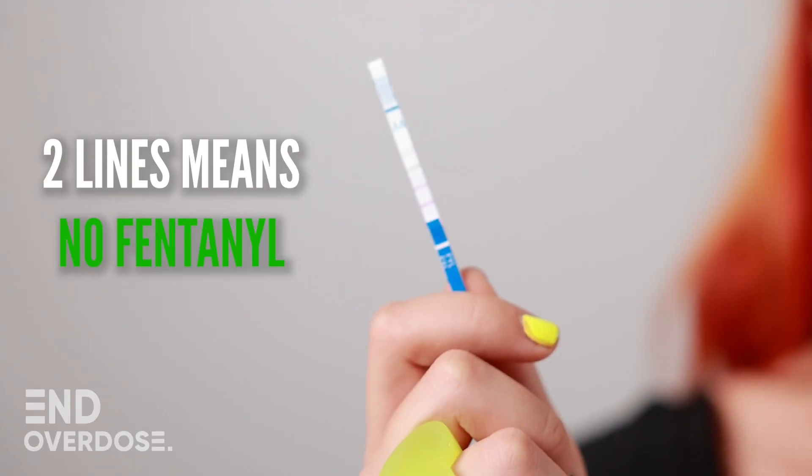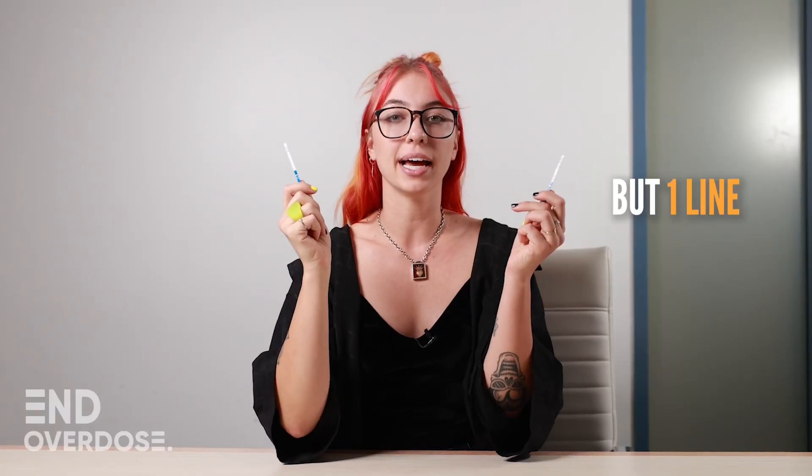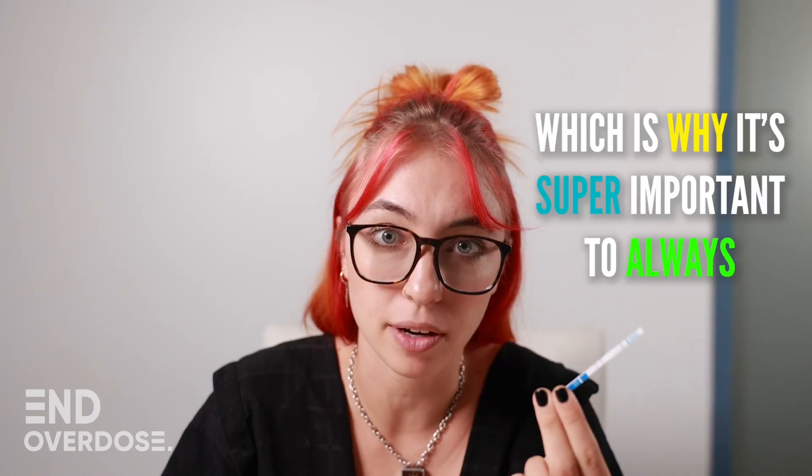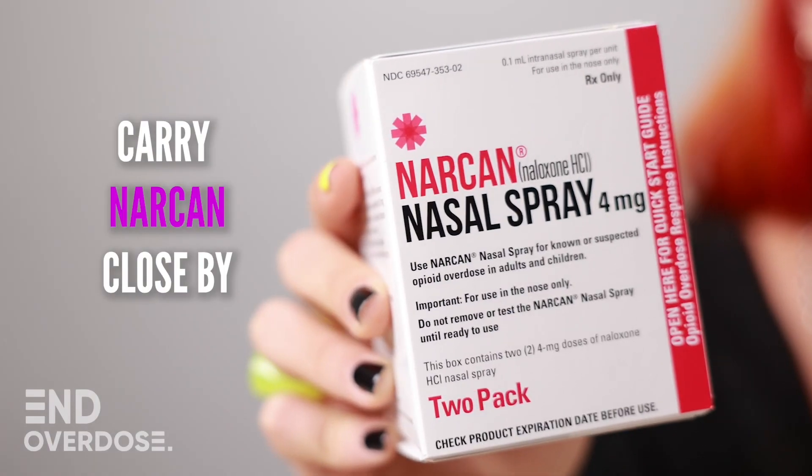Now you got your results. Two lines means no fentanyl. But one line means your substance most likely has fentanyl in it. False negatives absolutely can happen, which is why it's super important to always carry Narcan close by.